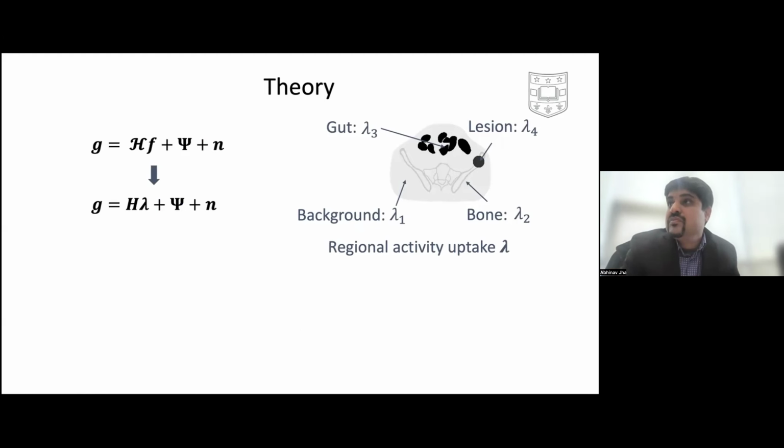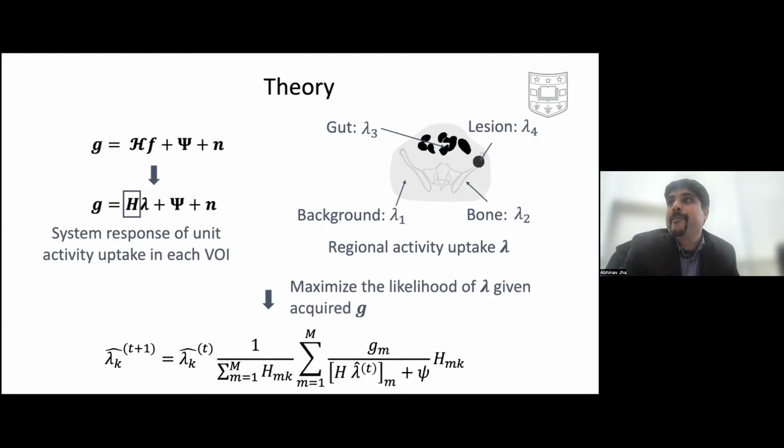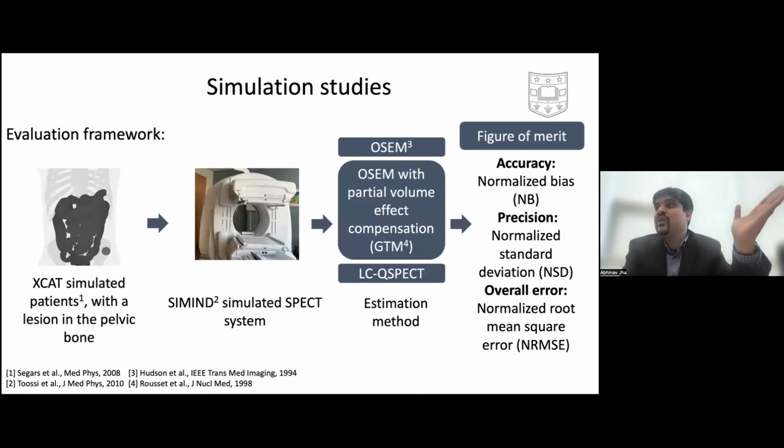For the figure that you showed on the last page, what's the iteration number you compare for? It should be a fixed iteration number. We did convergence studies, and the results that I'm showing you are obtained after the methodology converged to a certain value.